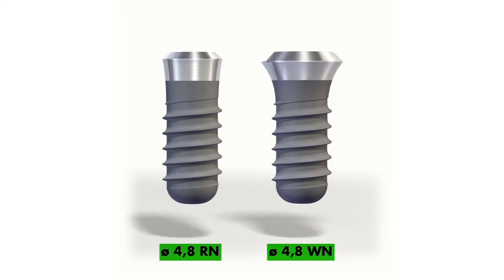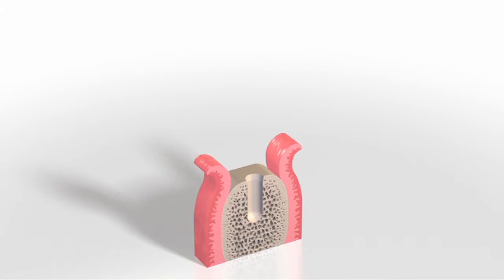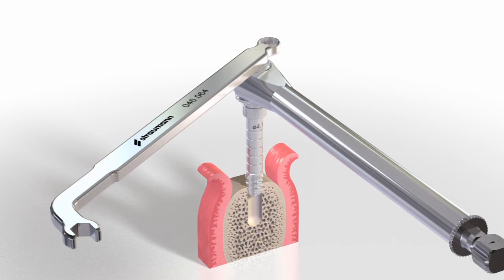Tapping should be used in the coronal area only, or to the full depth of the implant bed, depending on implant diameter and bone class. To prepare the ratchet for tapping, a ratchet adapter has to be connected to the tap for adapter. The standard tap is inserted into the cavity, and the ratchet is placed on its coupling.